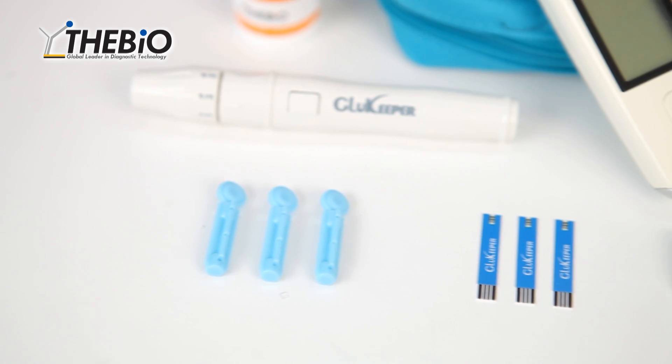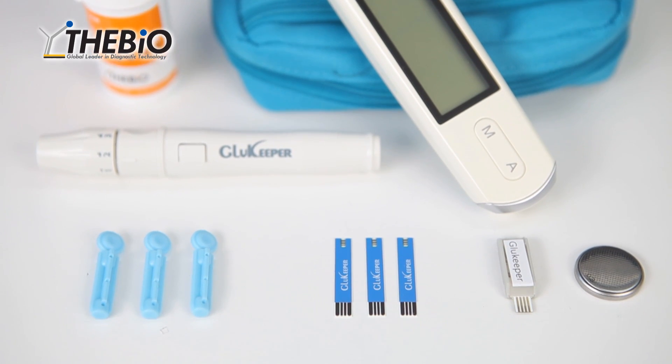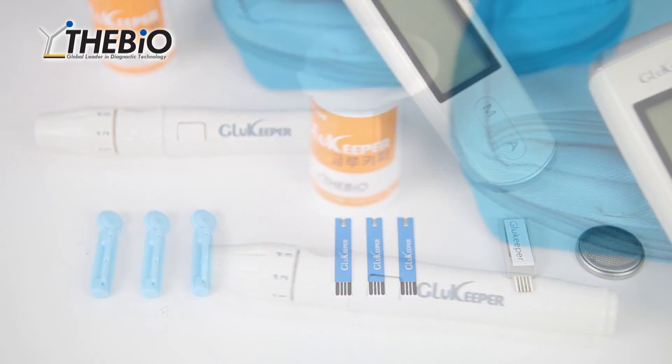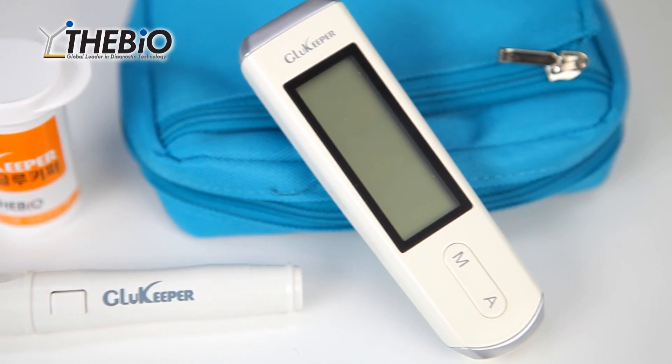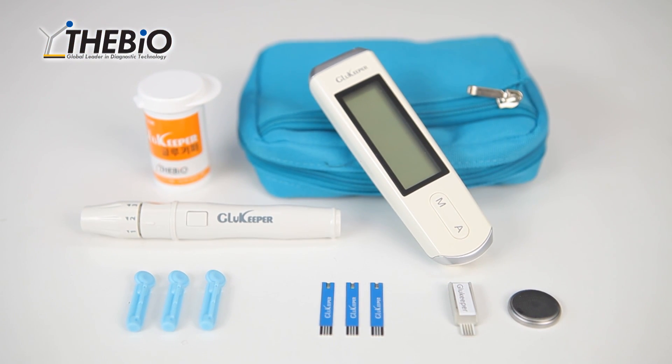Due to the enhancement of measurement technology, you can now verify your blood glucose level even with a tiny amount of blood within 5 seconds. The superior measurement system uses a code chip, so now you don't have to go through the hassle of changing the code every time you use it.